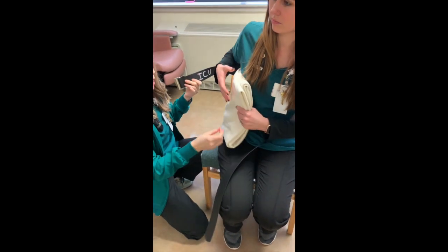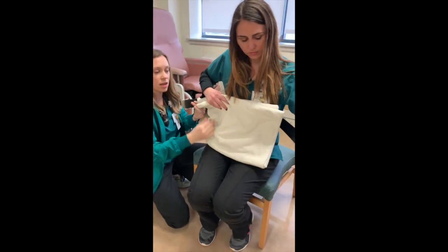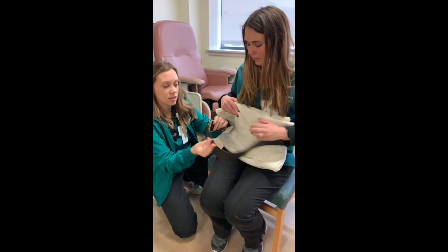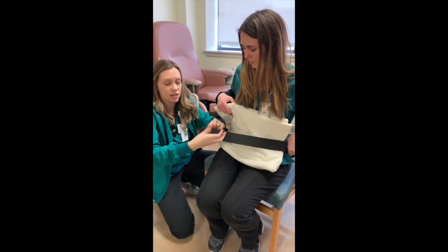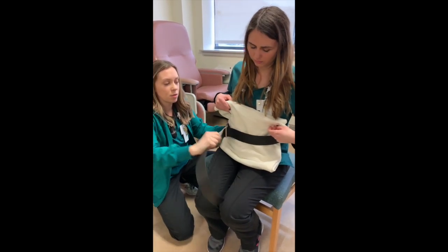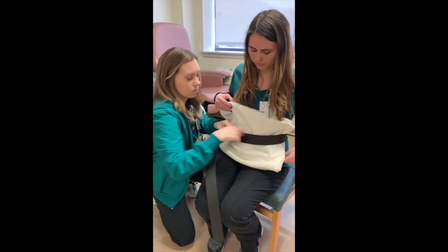And then for abdominal surgeries, if you put the blanket in the front and bring the gait belt around, it makes a nice brace if they're gonna cough, sneeze, or anything while you're moving, but also just gives them a little bit more comfort while they're moving.